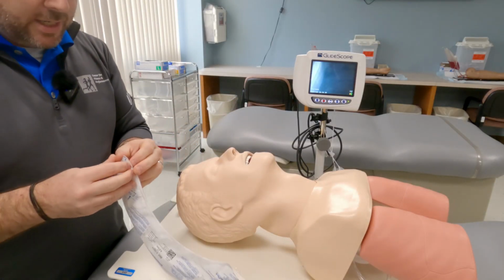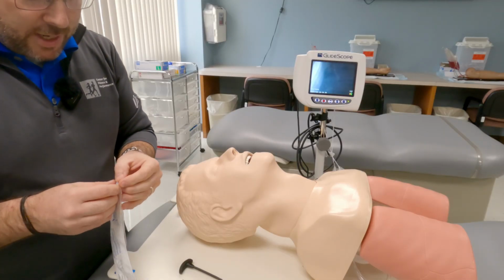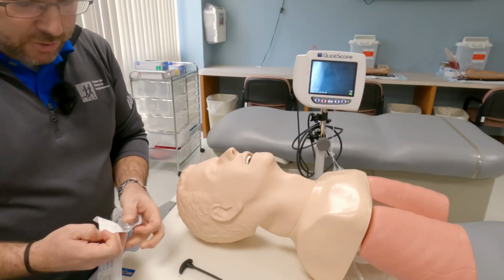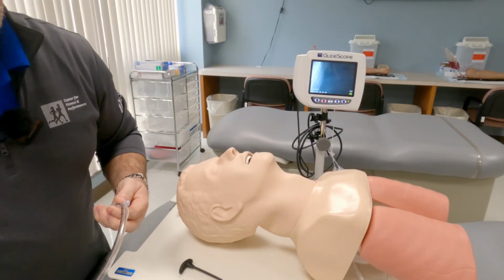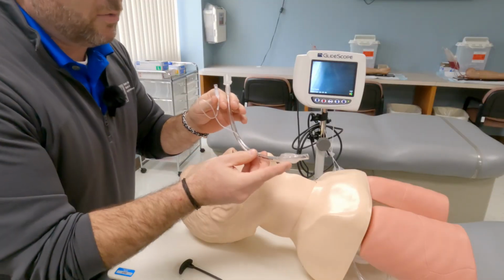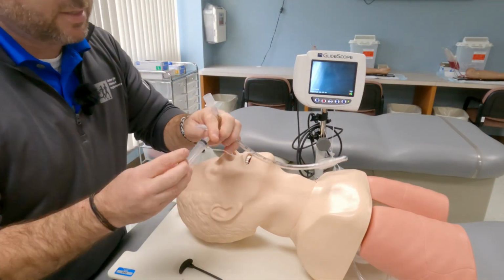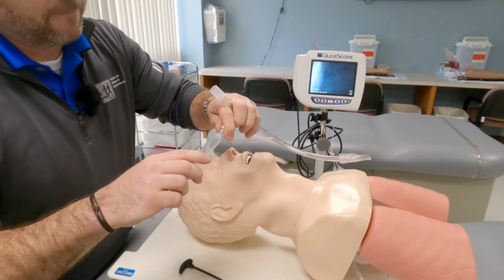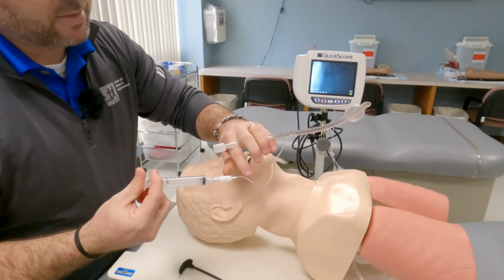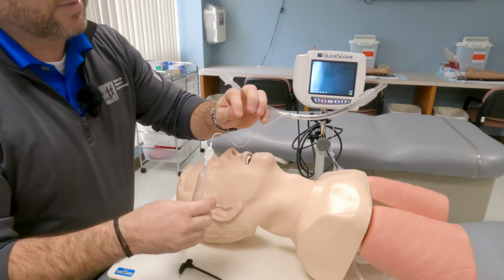Let's go with an endotracheal tube. Obviously, it's going to be done the exact same way. In this case, I'm using a smaller tube just for demonstration purposes. Just like any other time you're going to intubate, you're going to want to make sure you check your pilot balloon first to make sure it properly functions. You do that by inserting 10 mLs of air into it. It seems to hold, and in my case, I always just leave this attached.